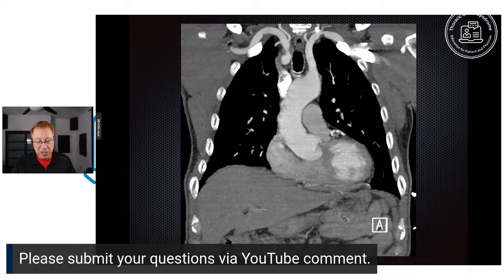So this is a CT angiogram. Remember we talked before about a direct angiogram or catheter angiogram. We actually have to puncture an artery and run a plastic catheter and then inject the dye. Well, this CT scan is done with a small cannula or small IV in the crook of your elbow. And you inject the dye, you watch where it flows, and at the right time, you do the CT scan.